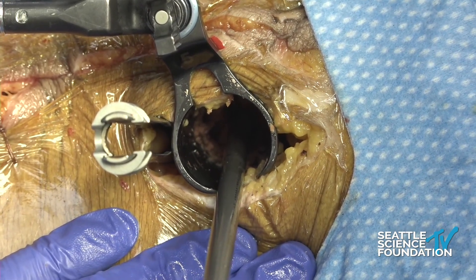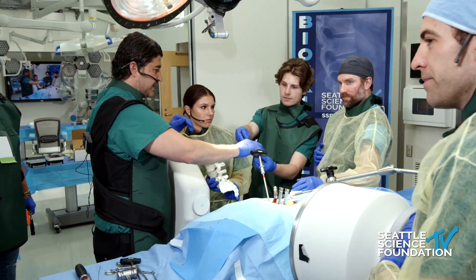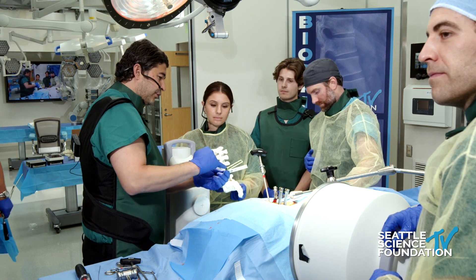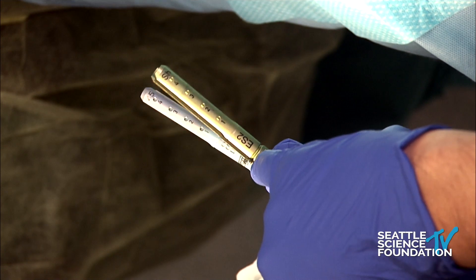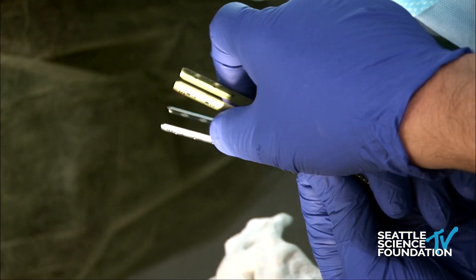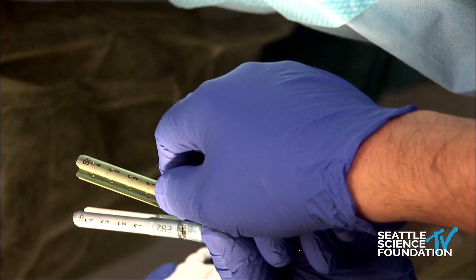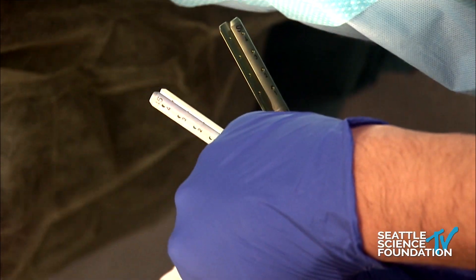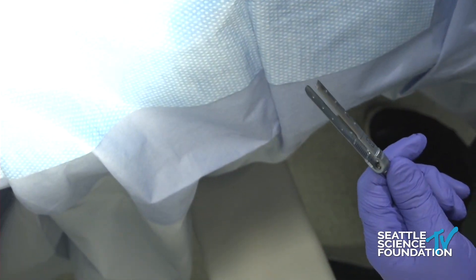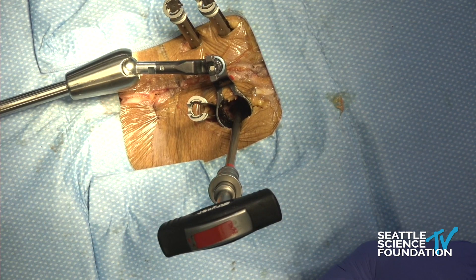Essentially we've done a facetectomy. Today we're using the minimally invasive screw system. This one I'm very fond of because it's got threaded reducers — not only for the rod insertion, but also to reduce the rod. A lot of these systems are poorly designed because companies will design the open system and add tabs on it, and that's not ideal. What you want is threaded reducers inside so you can push the rod down. It's very hard to put a reducer on top with the skin. So this is one of my go-to percutaneous systems.